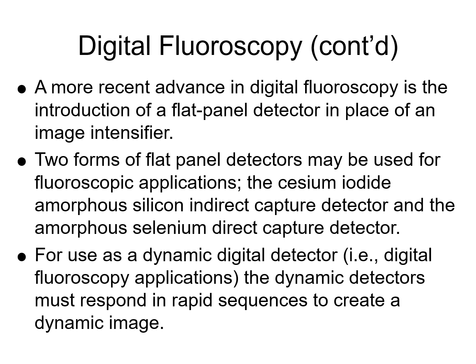That's an indirect DR plate. It is third generation CCD technology that has been improved. It's been expanded to an 18-inch by 18-inch area, given separate data lines for each row and separate control lines for each column. And so the way we unload a flat panel detector is pixel by pixel, which does reduce noise better.